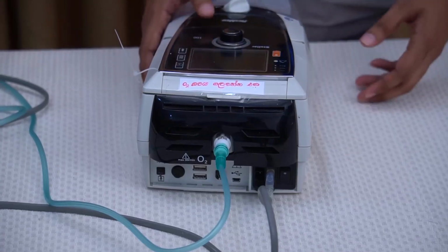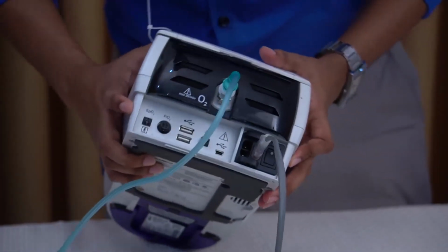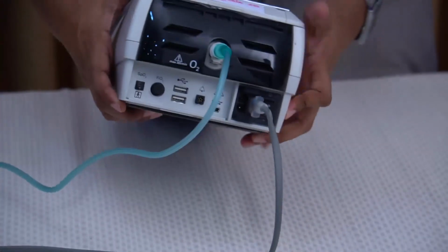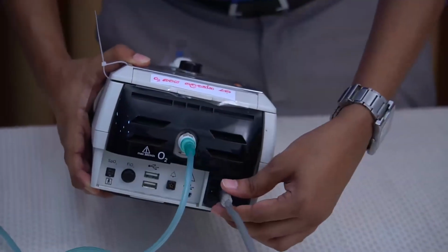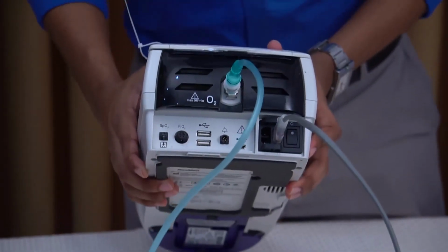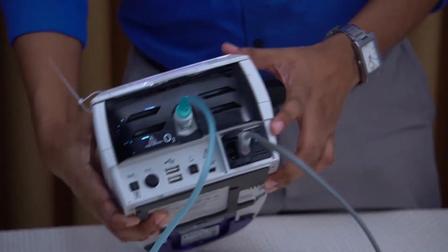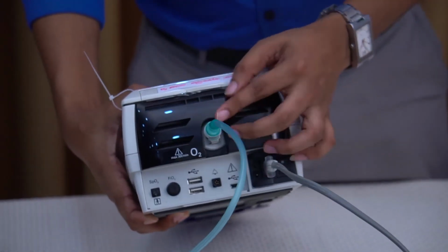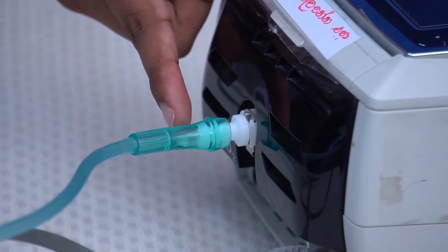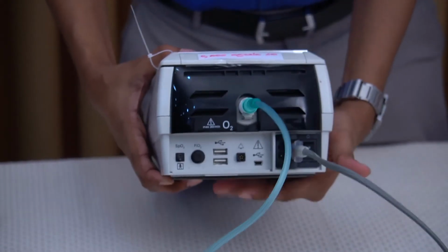Main unit. The main unit is powered by an AC current or an inbuilt battery. However, it is advisable to connect to the main current using the supplied current cable. The rear surface of the main unit contains several connection ports and a switch. 1. Oxygen connection port. This is an easily damageable piece and should be handled with care. It is better not to detach it from the main unit. The oxygen source should be connected to this port by a tube.